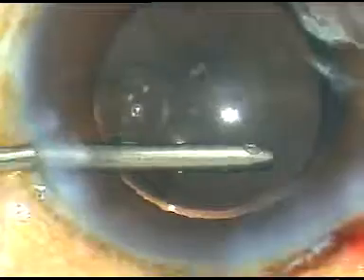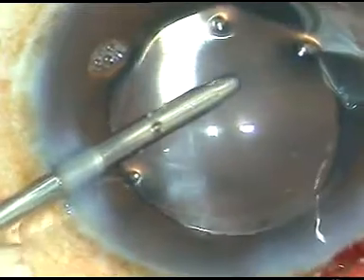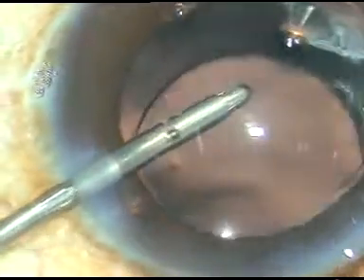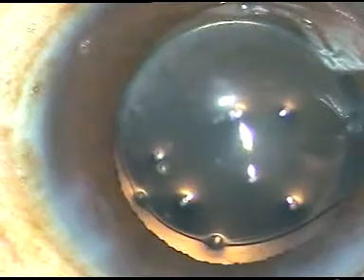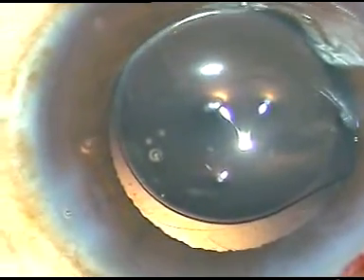The intraocular lens is rotated a little bit with the help of a Sinskey hook. I am ready to depress this haptic-optic junction. I depress this and with the help of the Sinskey hook, I send the haptic into the equator of the capsular bag.